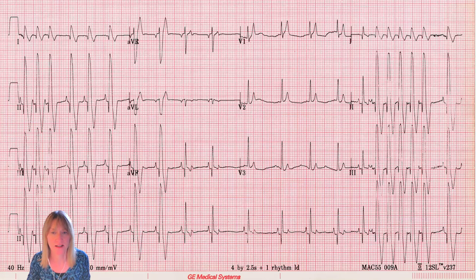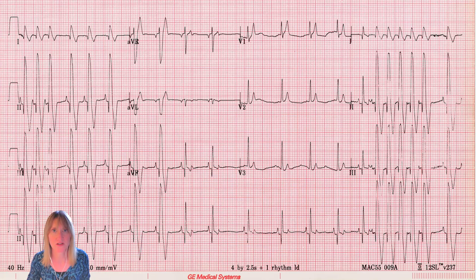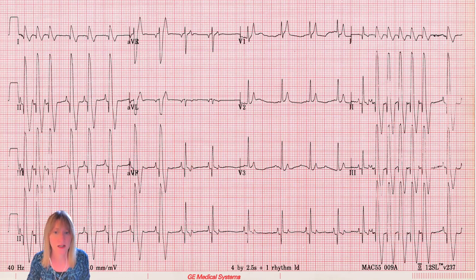We have nine leads in the top three lines and a lead two rhythm strip along the bottom. If you watched the last episode, what you'll recall is we have sort of two separate morphologies here — the section in the middle represents normal conducting sinus rhythm, and the sections on either end we concluded represented a left bundle branch block. Still a supraventricular rhythm, but with a conduction abnormality called left bundle branch block, explaining the wide and bizarre QRS complexes.